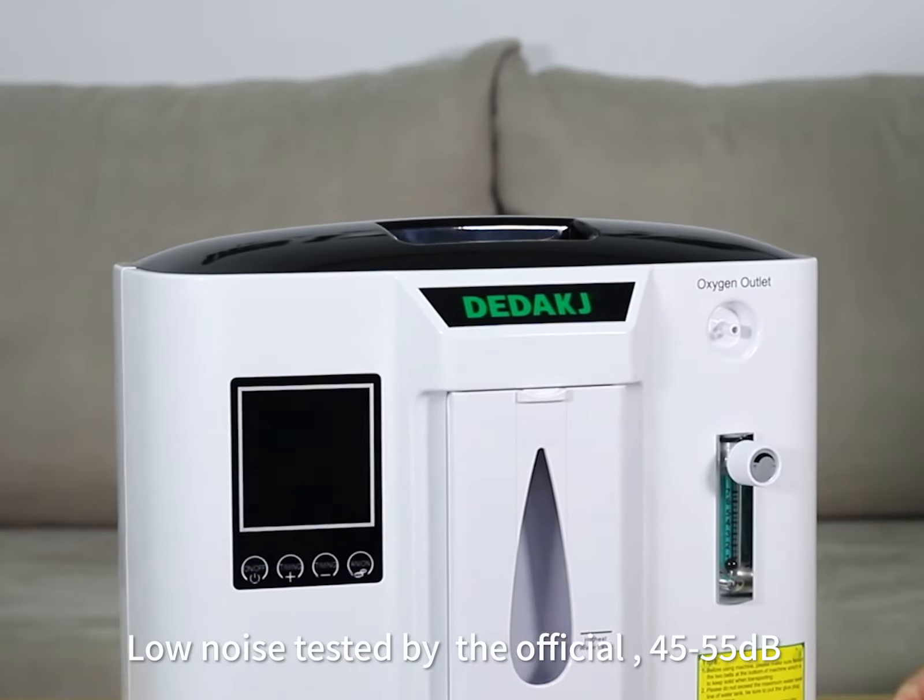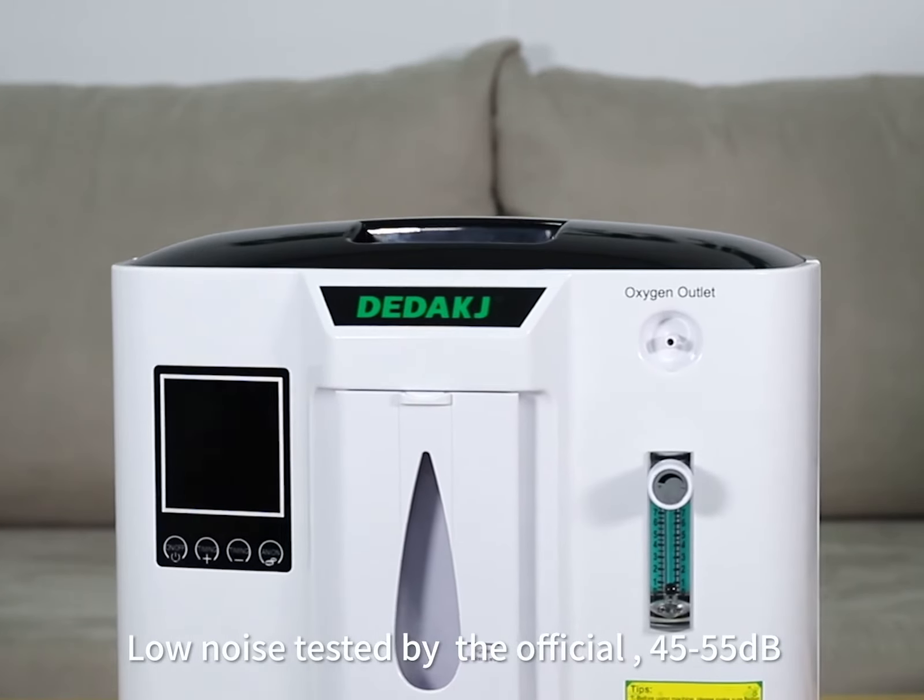No noise, tested by the official — 45 to 55 decibels.